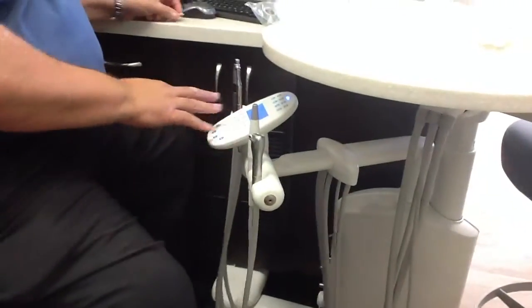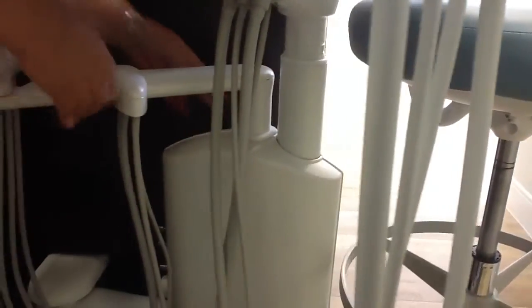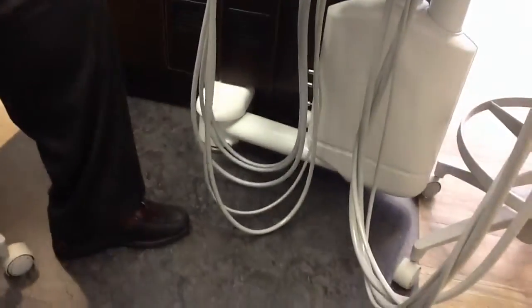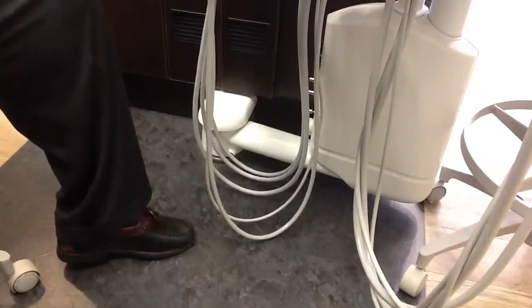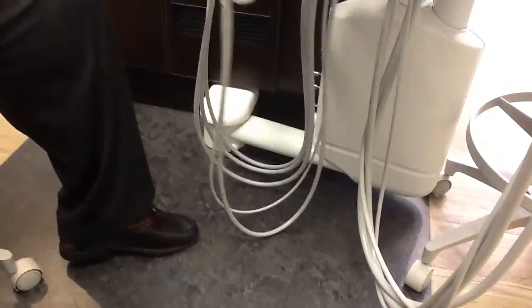There we go. Okay, a couple of other things that you should be aware of, and that is the height adjustment that you've got with this unit. So if this is a little bit high for you, and you would like to have it be a little bit lower, you can bring this down here. Obviously, the lower you go, the more your potential for the hose is dragging on the floor and getting rolled over by the stool, so you want to be a little bit careful with that. Okay. But it does give you some height adjustment with your instrumentation.